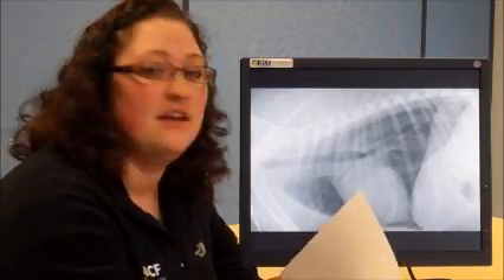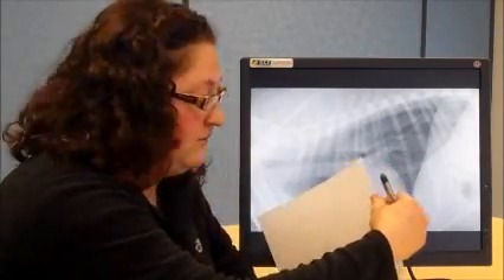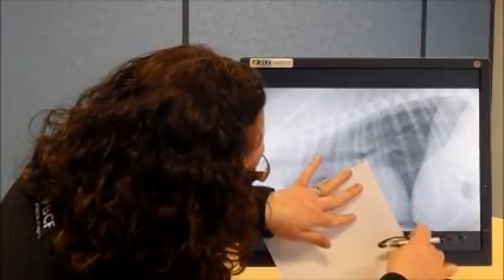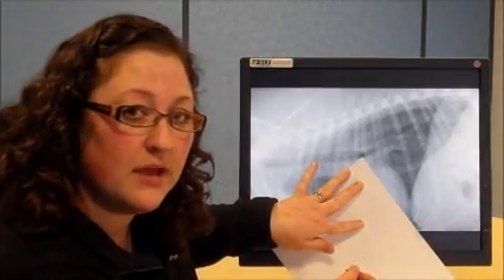The first measurement you need to obtain is the length of the heart. You do this by taking a piece of paper and a pen. You will start by obtaining the length of the cardiac silhouette. Place the tip of the paper at the ventral border of the carina and take that all the way to the apex. You will then make a mark on the piece of paper along the border to indicate the length of the cardiac silhouette.